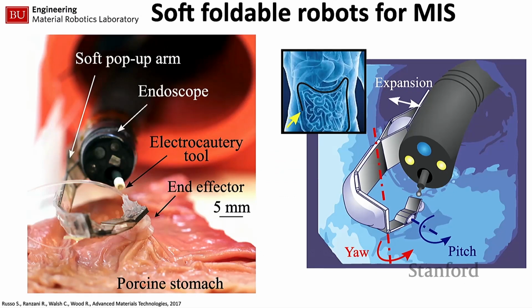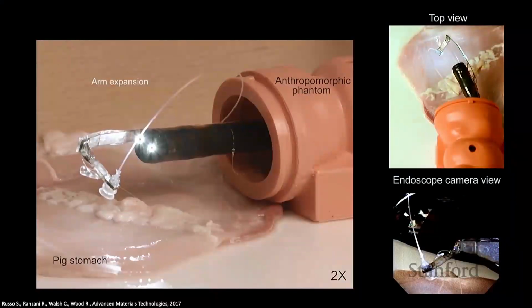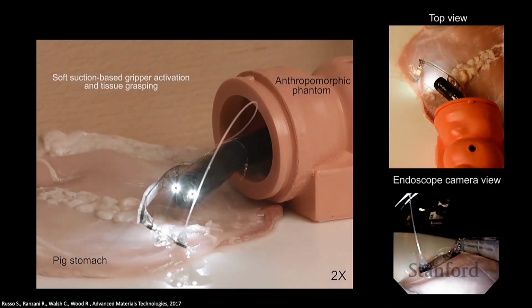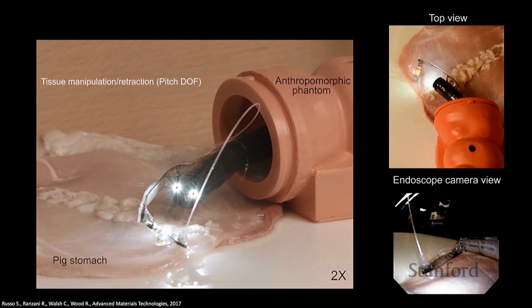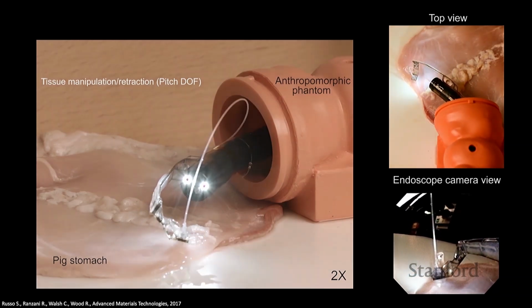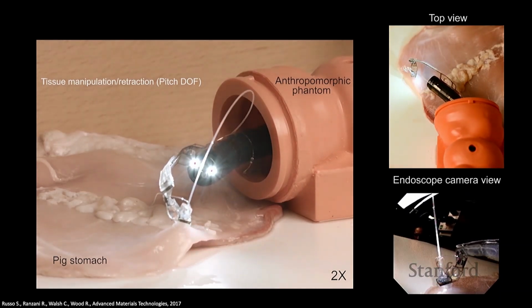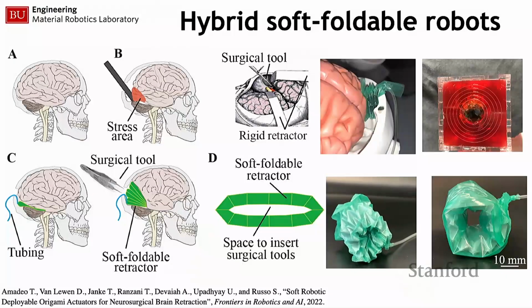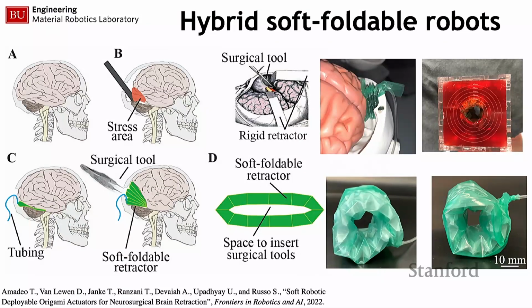So one of the things that we did with this technology was developing, like I mentioned, robotic add-ons. So for example, multi-degrees of freedom robotic arms that could be placed at the tip of a colonoscope to perform tissue manipulation, and especially one thing that is called tissue retraction. In this case over here, you can see that we have a vacuum gripper as the end effector of the robot, and the arm is basically helping lift this tissue up so that we can perform tissue biopsy and so on. So that was part of my previous work as a postdoc at Harvard.